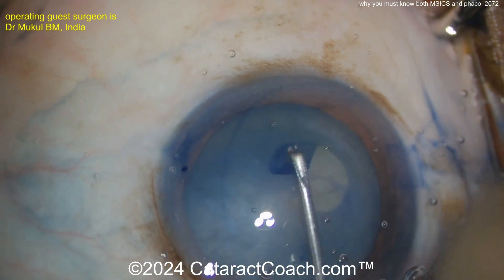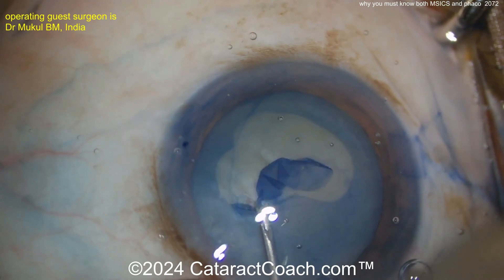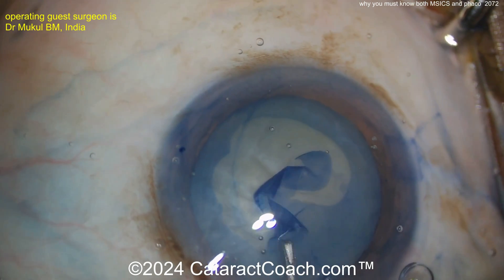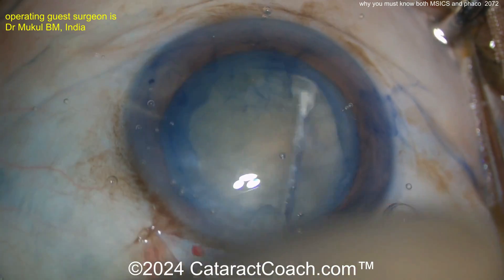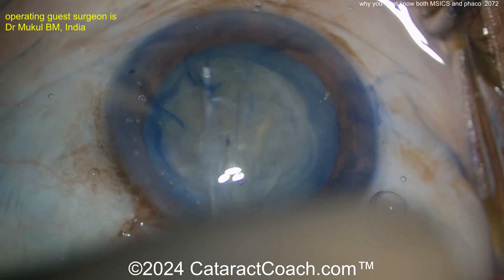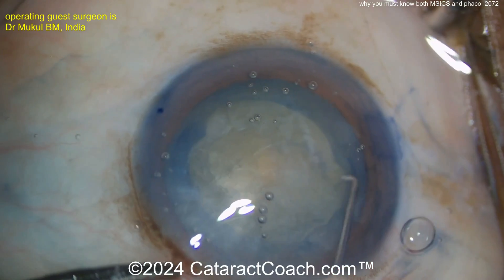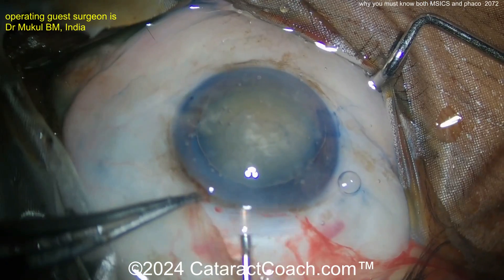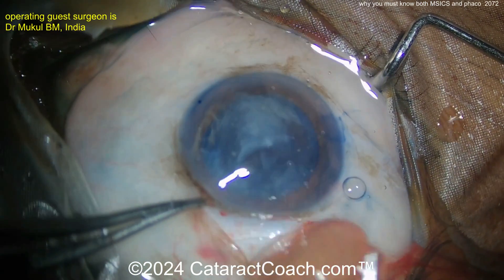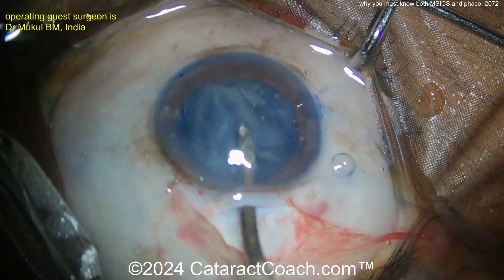You can see the rhexis being done — it's important to get a good-size rhexis here because you're getting the whole nucleus up out of the capsular bag. Of course we've sped up the video. Even in our Beverly Hills Surgery Center I end up using MSICS at least a couple times a year. I use it for absolutely brunescent, coca-cola cataracts. This lens is reasonably dense but mostly opaque, and you can see it's easily extracted.